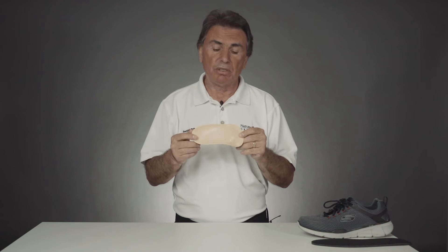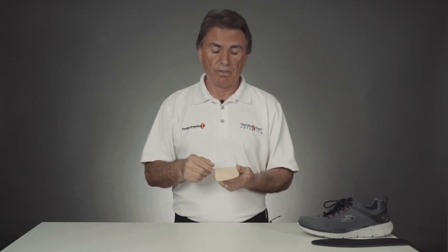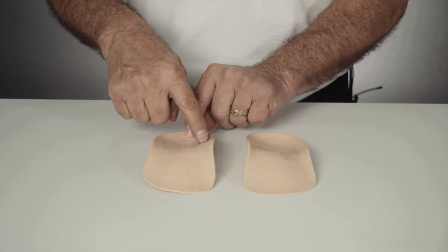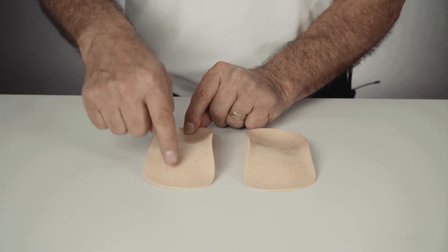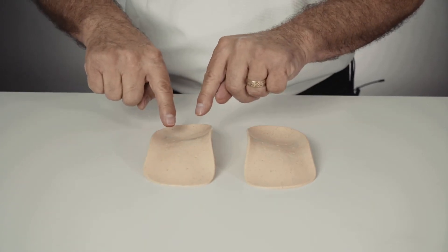I've seen amazing results with this product over the years. You're going to stand taller, you're going to feel more erect, more stable, more balanced, and it's going to support all four arches of the foot. The inner longitudinal medial arch, the outer longitudinal, the metatarsal arch, into the transverse arch with a nice deep heel cup to control the motion of the heel.